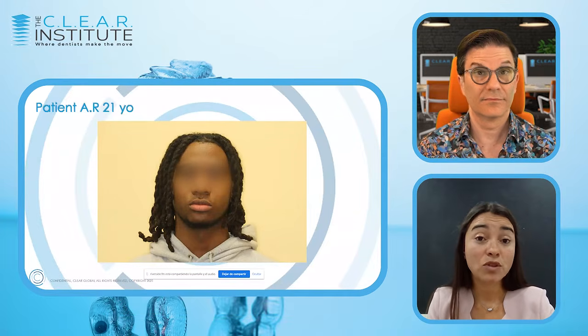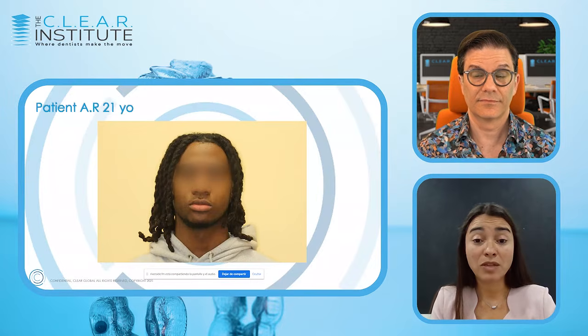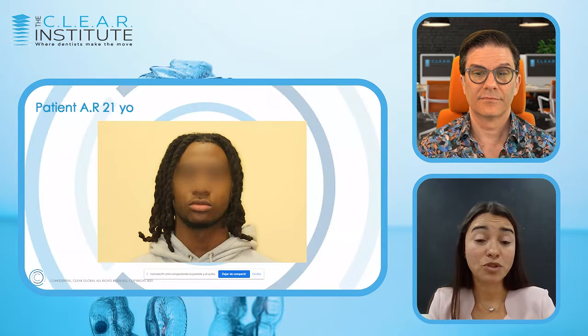The treating doctor is the one that gets to know the patient, of course. So everything that you see on your patient: what is the main goal for the patient? What is the patient looking for? Is the patient having or showing any signs of a habit? Is the patient walking straight? All of these physical things that you can see from the patient when you have them in your office, make sure you write them down, and make sure that you inform these conditions to your treatment planning service so we can have them when we're doing the evaluation.